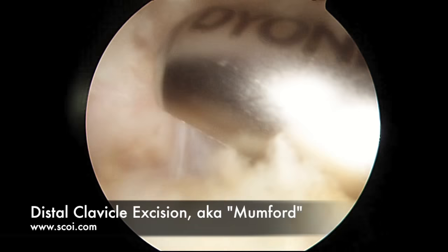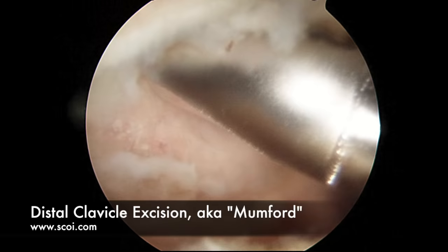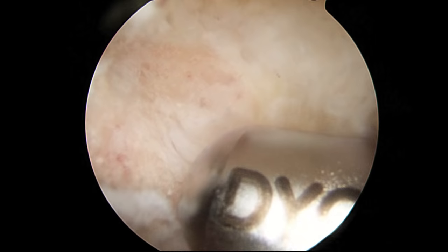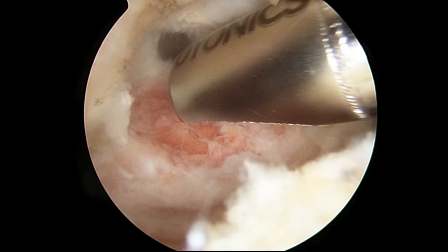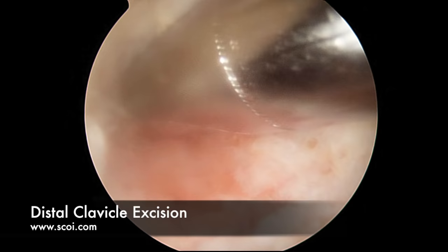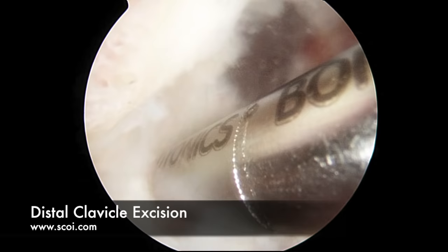It generally requires only about a week in a sling, but it can still be sore and somewhat sensitive for two or three months. If you look closely, you'll see a bone cyst right there in the end of the collarbone — that's a sign of osteoarthritis and oftentimes correlates with pain. As we've progressed from anterior to posterior, we can see the removal of the bone, and now we've come all the way across the end of the collarbone.